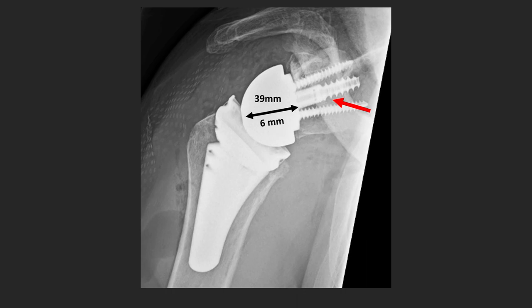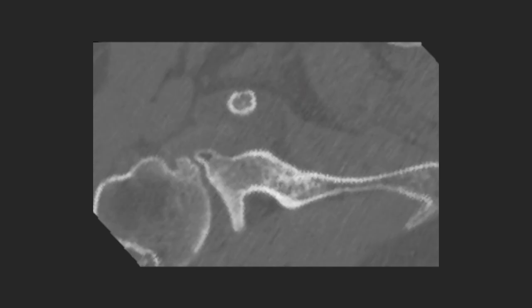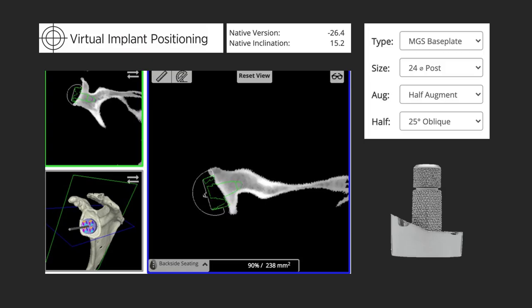Here's another case — an example of a half wedge. On CT we have a really significant B2 glenoid occupying about 70% of the glenoid, with 26 degrees of neoglenoid retroversion. Of course, we're going to have a higher rate of failure with anatomic arthroplasty, so we select an augmented implant. In this case, the half wedge lines up very nicely and we're able to get correction of this deformity.